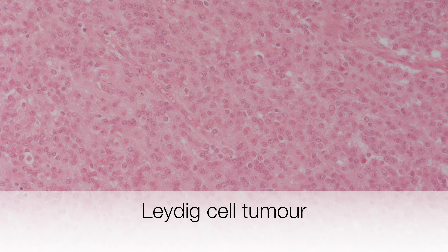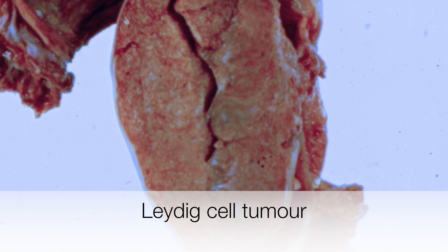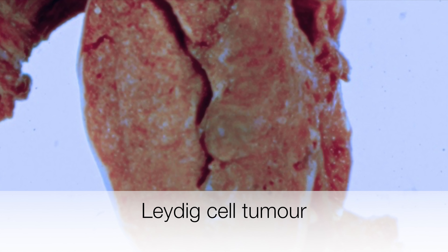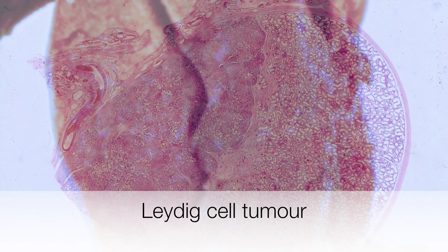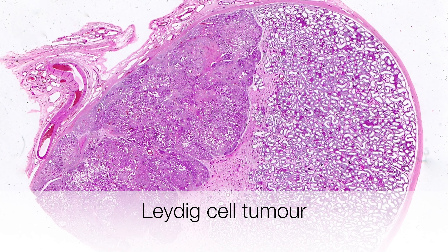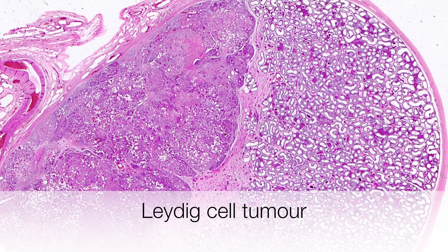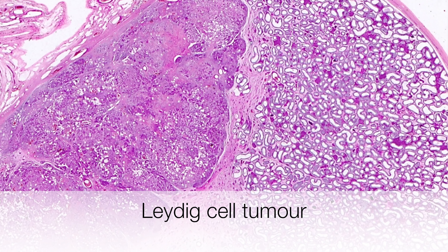Here is a Leydig cell tumour that has been stained for inhibin. This testis contains a Leydig cell tumour and it is the pale brown well-circumscribed lesion we're zooming into at the centre of the picture. And this is an H&E of a whole mount section of a testis that demonstrates just how well circumscribed this Leydig cell tumour is. Notice the lesion at the left side of the testis.